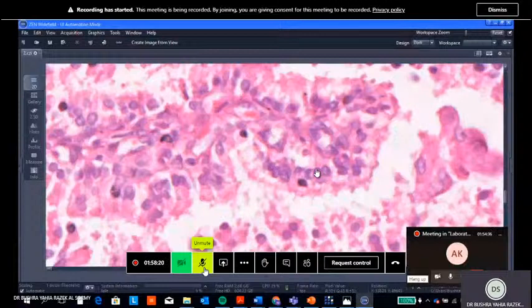It's not ground glass, and no pseudo-inclusion, no grooves. Also, there is no fibrovascular core here. So it's just like a papillary structure, but because of hyperplasia, that's all. And they are crowding. There is no space, so they protrude to the lumen.